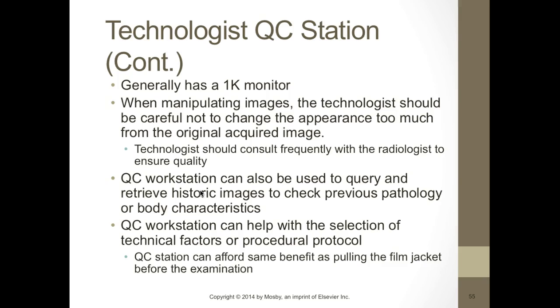When you save it and send it, the way you think it looks good is not necessarily the way the radiologist wants it. And when you do that, it changes it to where they have very limited window and leveling features. If you just leave it as it is, they can change it totally, whereas when you do it, it limits them. So please don't change or save the window and level. Take it back to its original and then send it.